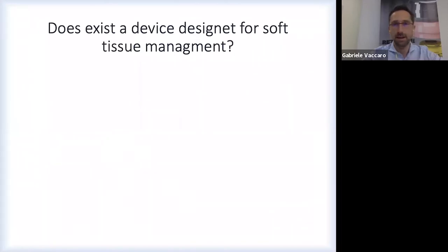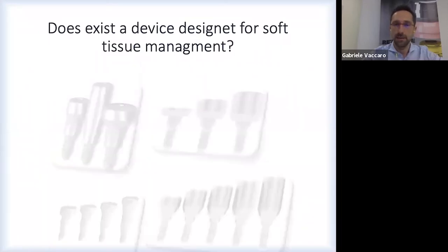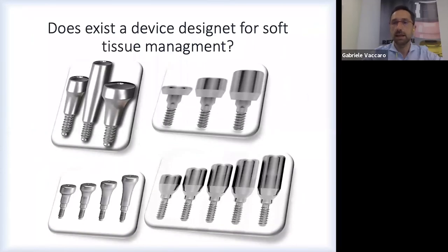The best device for soft tissue management is the healing screw. As dentists, we know exactly which height, which diameter, and which shape we want to give to our implant to come out from the gingiva, from the bone.